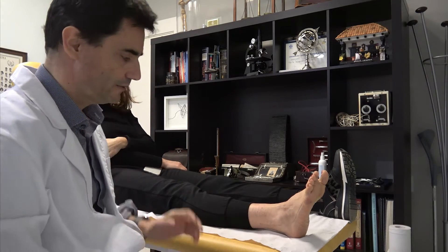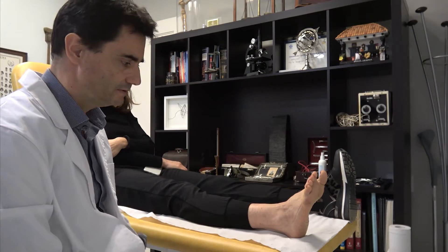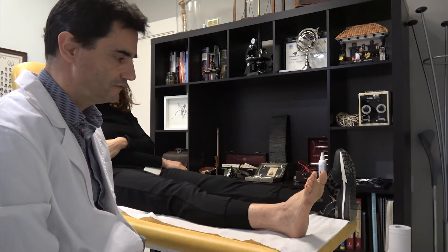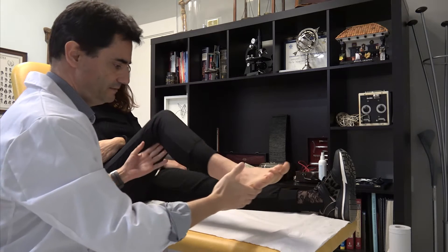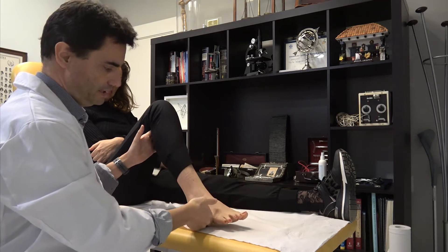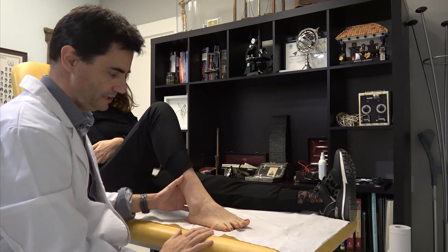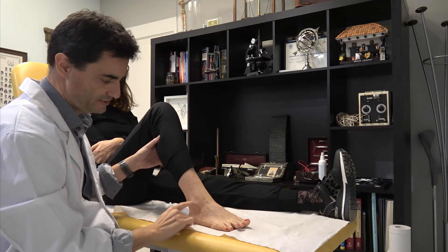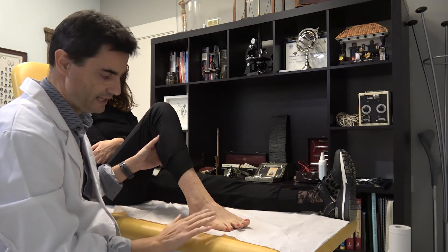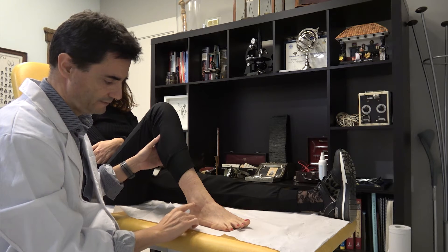Now I'm going to show you how I explore the lateral complex of the ankle. I put the patient seated or supine and ask the patient to flex the knee and slide the foot over the table. In this position, the anterior talofibular ligament has the same direction as the table, so it's very easy to seek and to find.